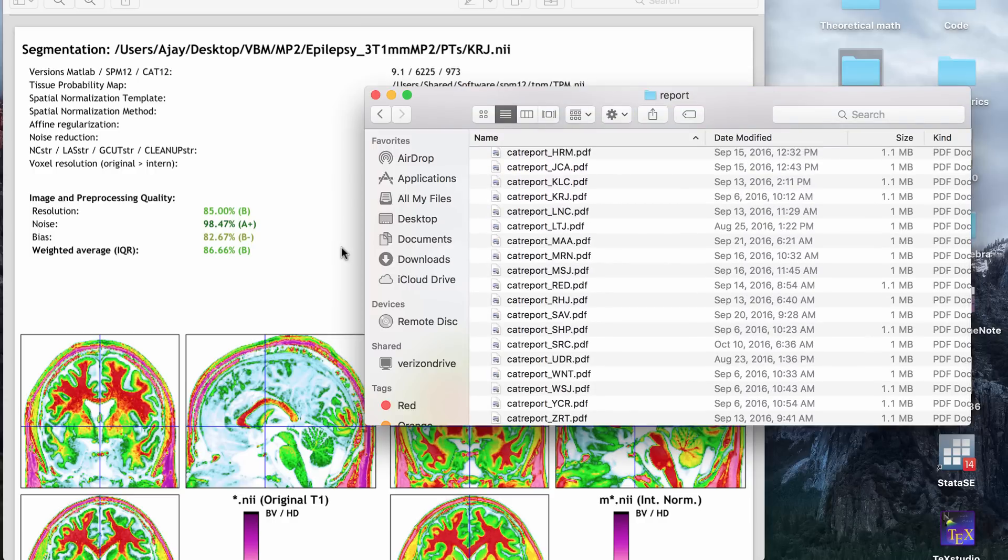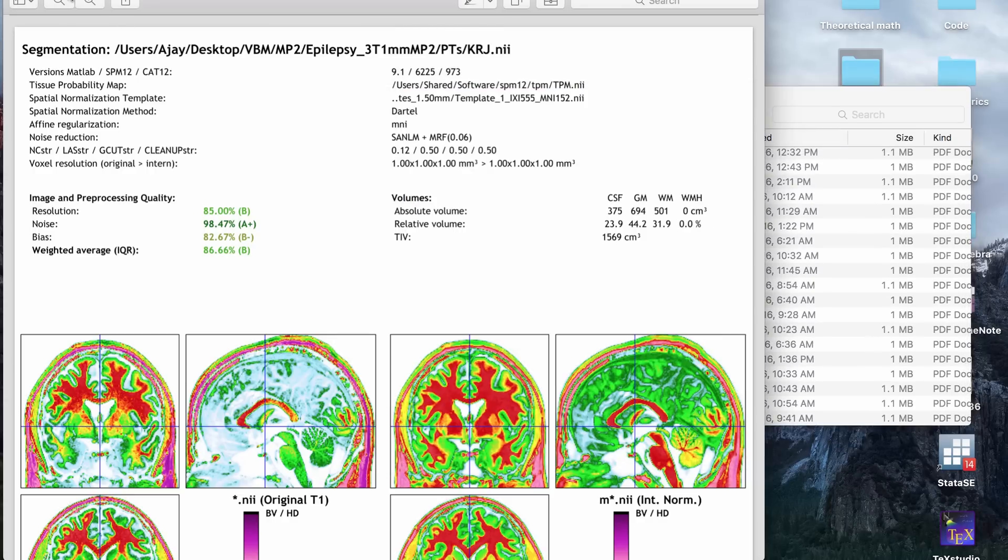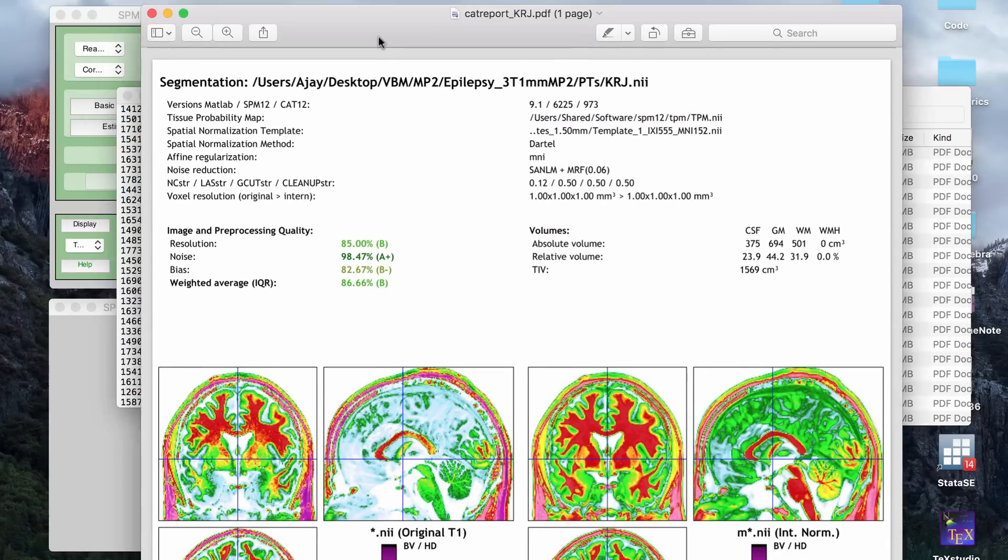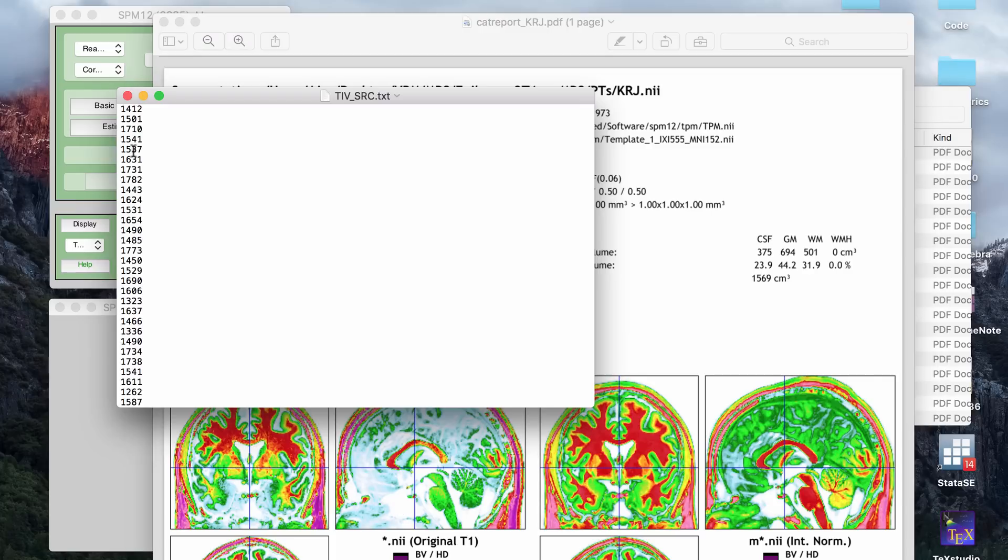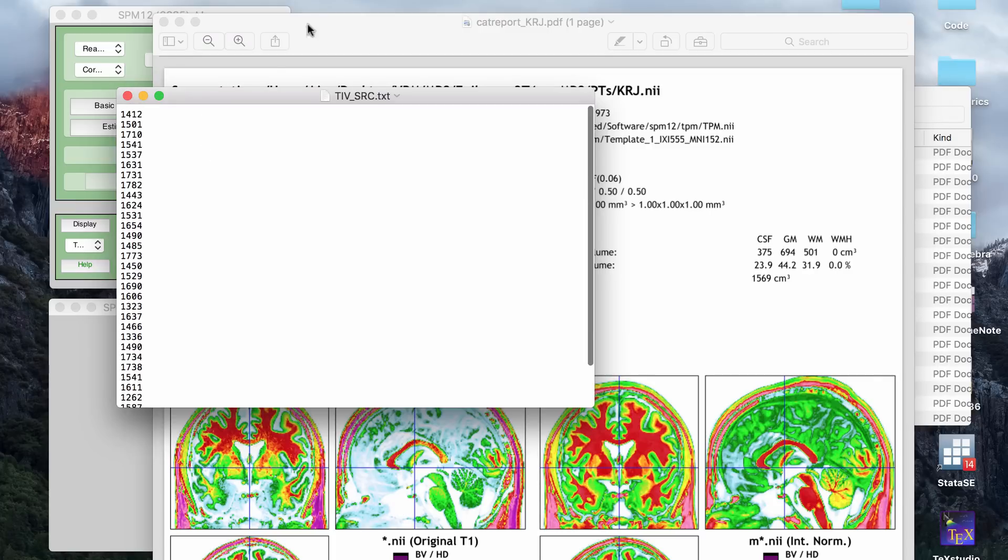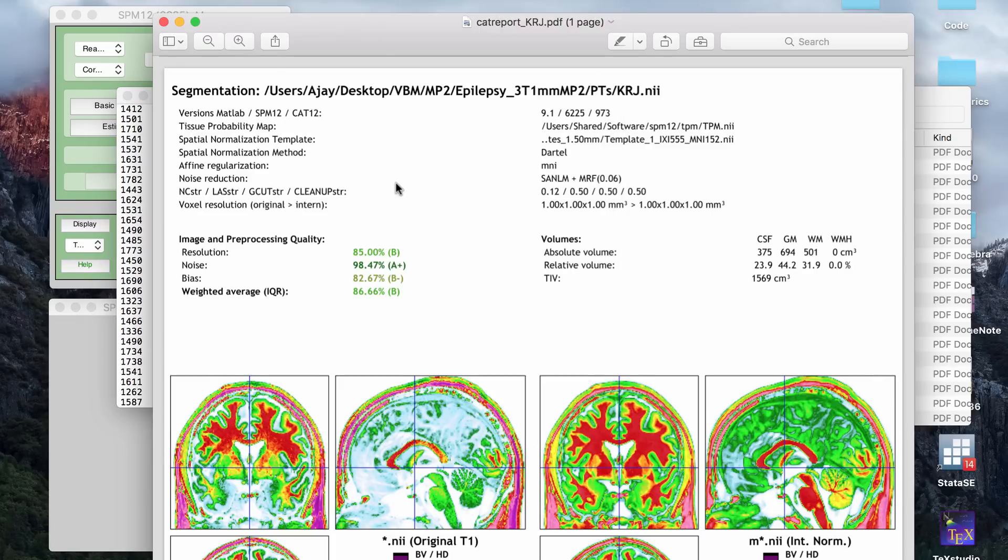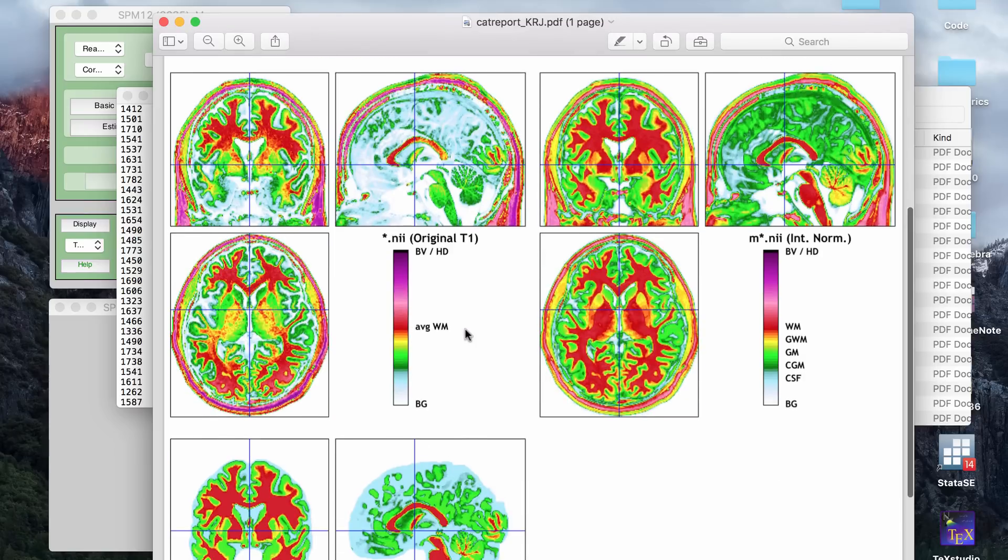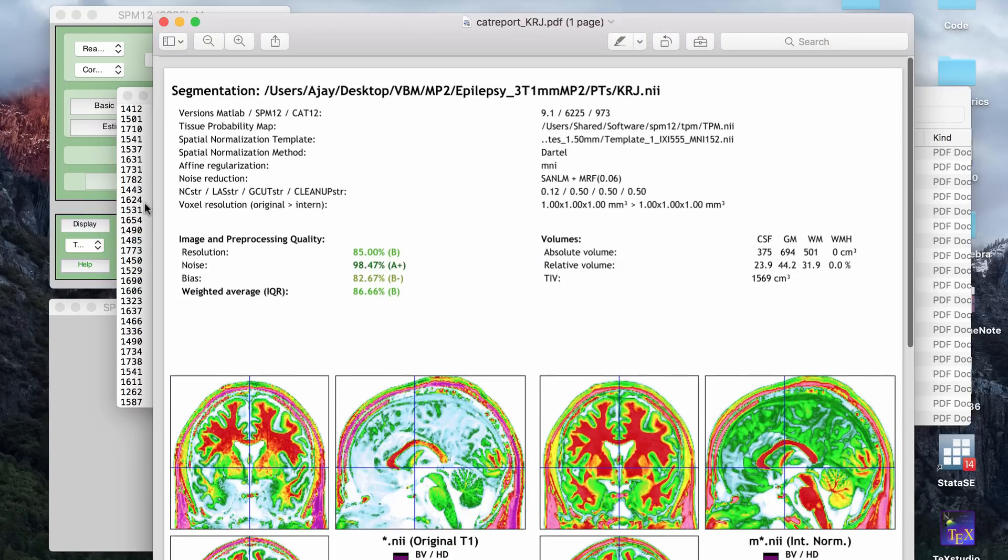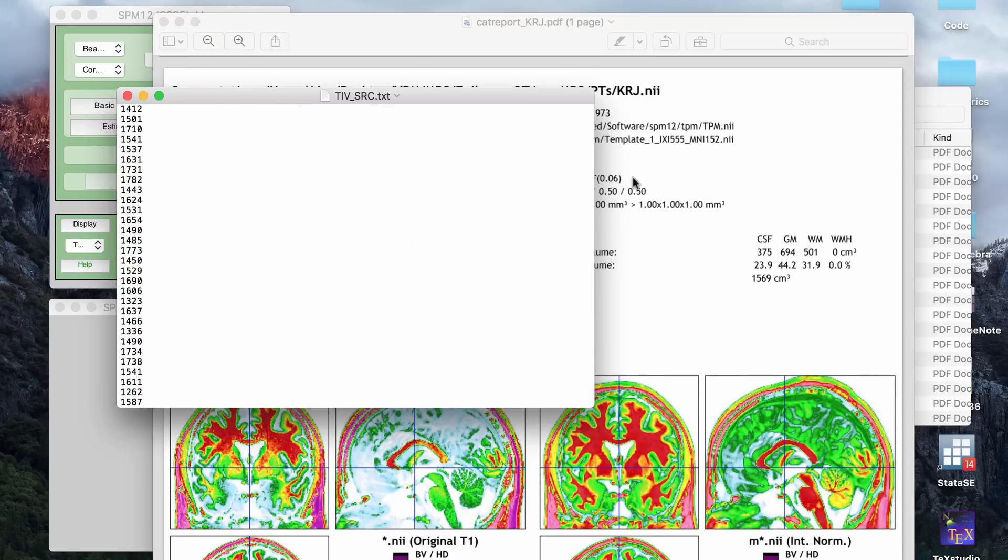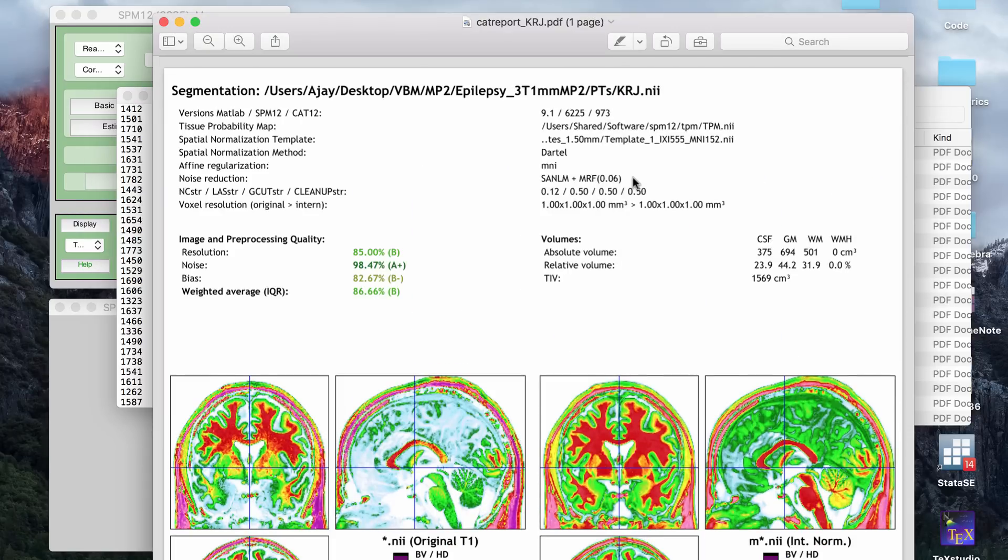Really, if you do it once, then when I update it, all I have to do is change the first line for each new patient. So it's not a big deal to update it manually, except you just have to do it the first time. And that takes a little bit of time. So if you go to each report, all you have to do is look here and it will tell you the total intracranial volume for each subject.